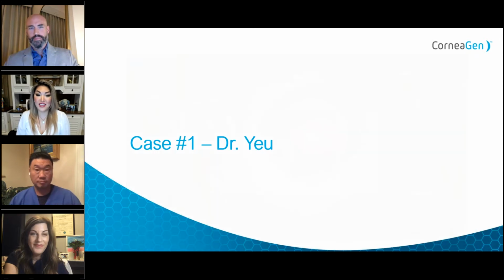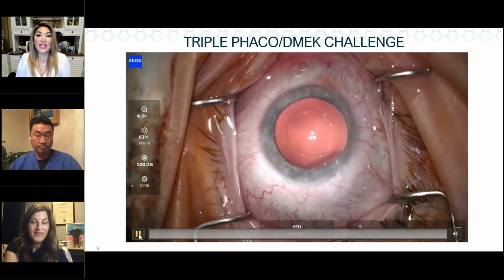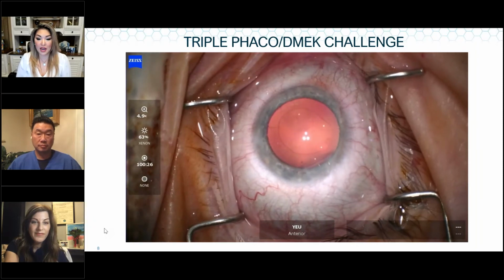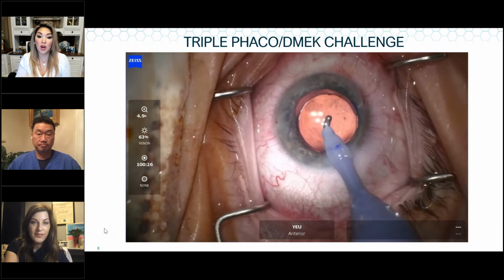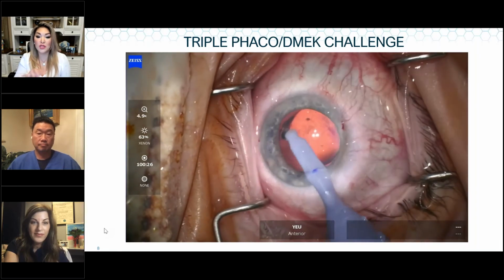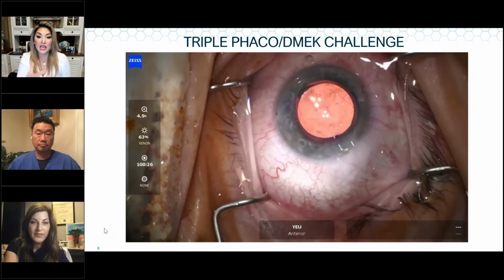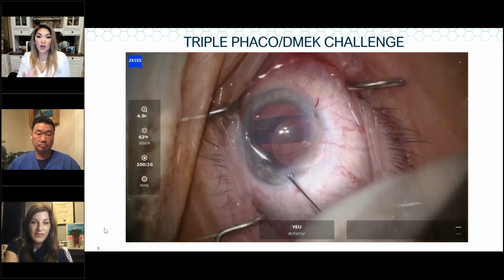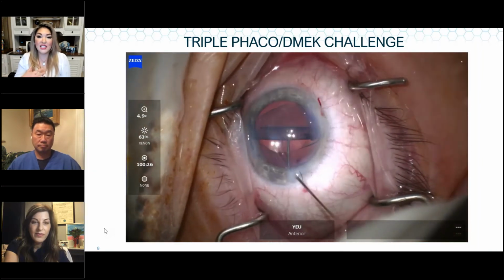Yes, actually, I'd love to get Terry and Nicole's advice on this. So, like I mentioned before, I'll just start the case. While it looks like a capsulotomy that may not be continuous, as you can see here, it is continuous, just a little oblong: 5.5 millimeters in the longer direction, 5 millimeters in the shorter direction. After I did a nice 8 millimeter strip, as you can see, I also used my IA to roughen up the deep stroma, but I just didn't even think about it.